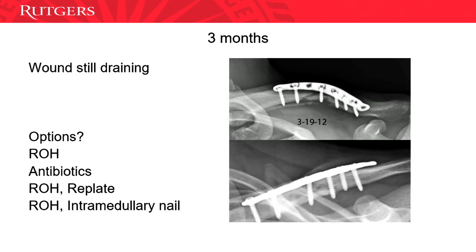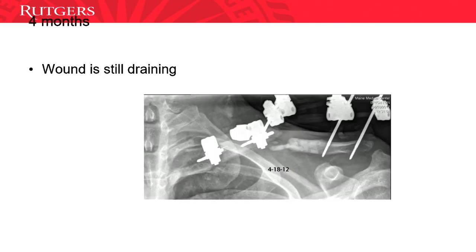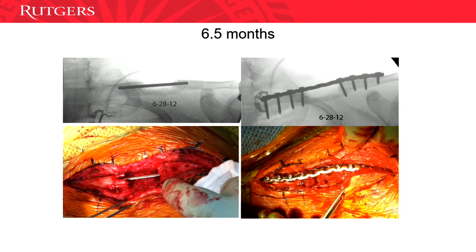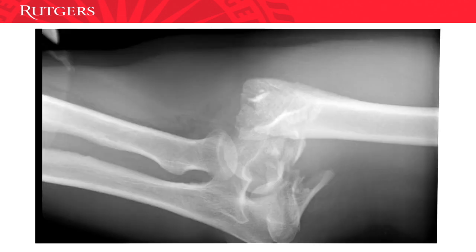It's rare to see a clavicle. I had one of my partners who actually did a clavicle X-fix. I've never done one, but it can be done. And he did this for a non-union, gave a little hardware break, put an X-fix on, and then ended up doing a spacer and healed it that way.